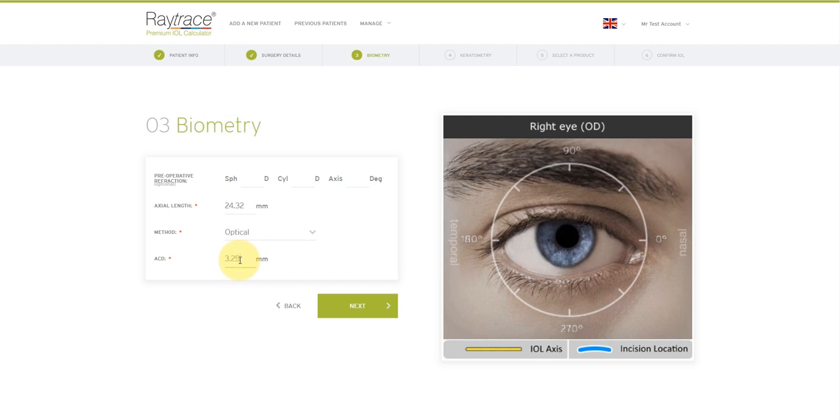For supplementary lenses, the only required information is the pre-operative refraction. However, anterior chamber depth, surgically induced astigmatism and incision location are also recommended for the most accurate calculation. Now we just click next.